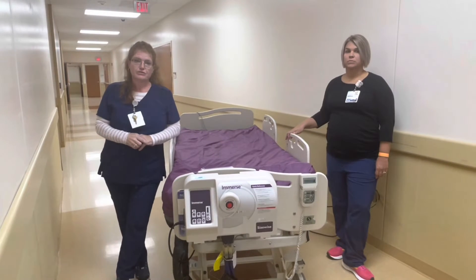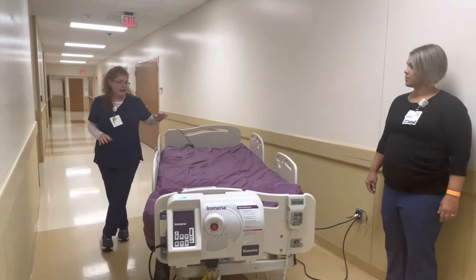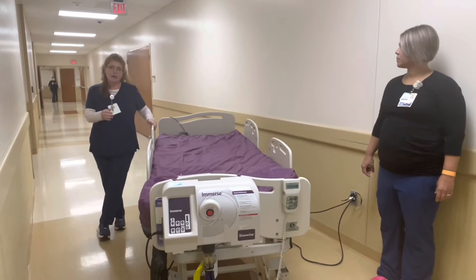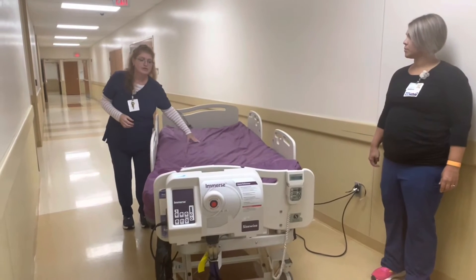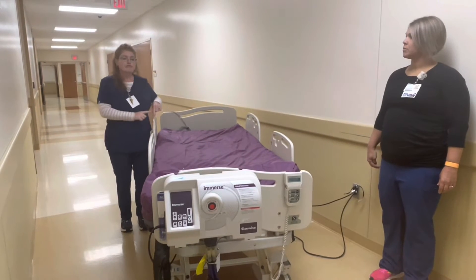The other thing that I want to touch on that's very very important: this bed, and honestly all of the rental surfaces that we bring in special, are all some type of pressure redistribution surface with a low air loss function.